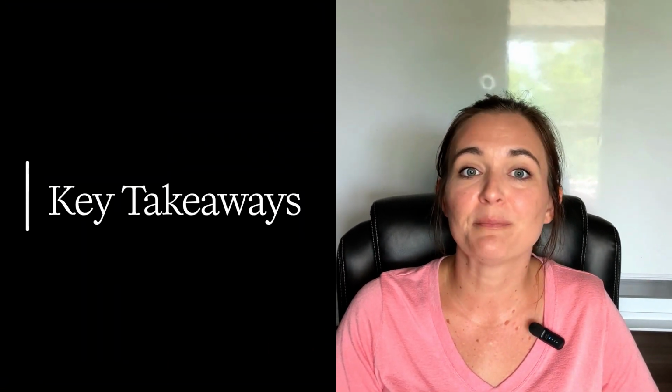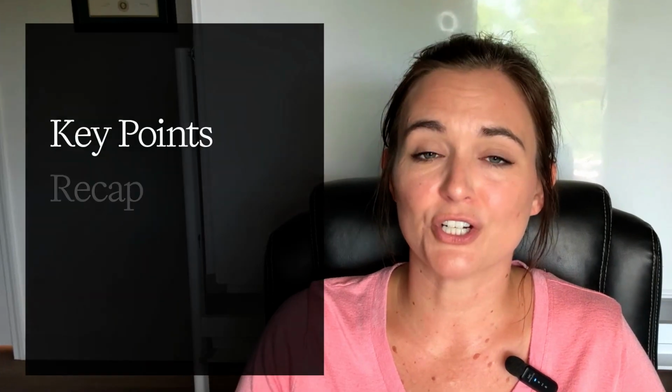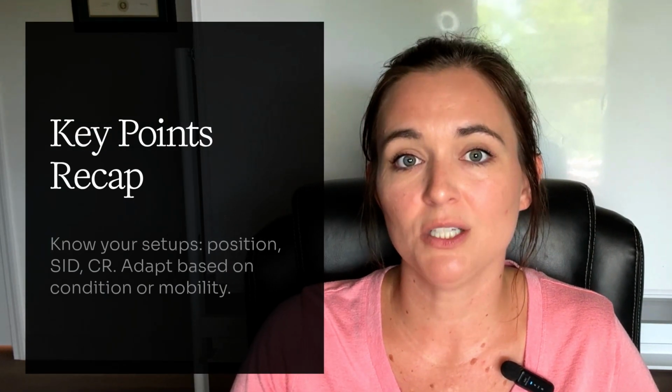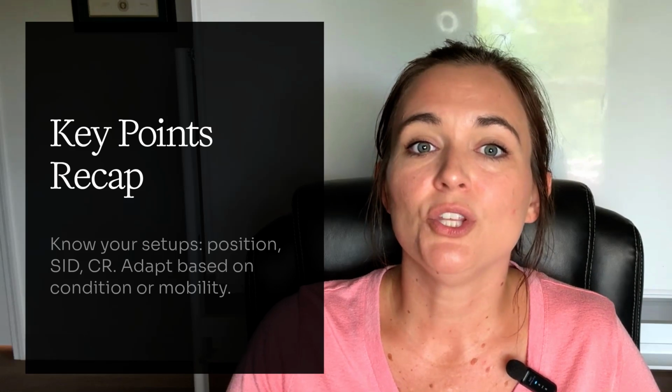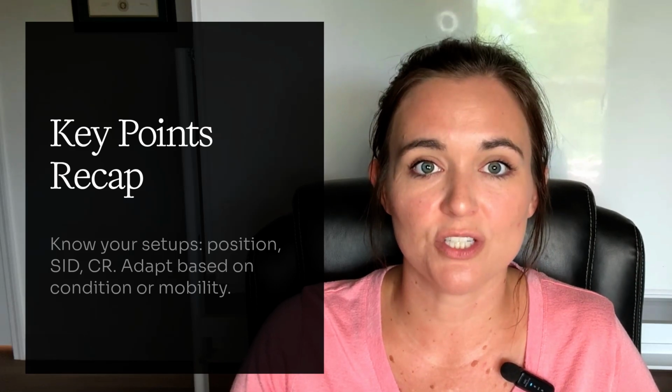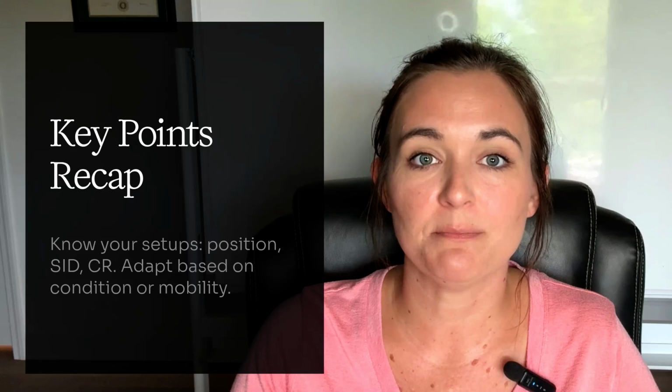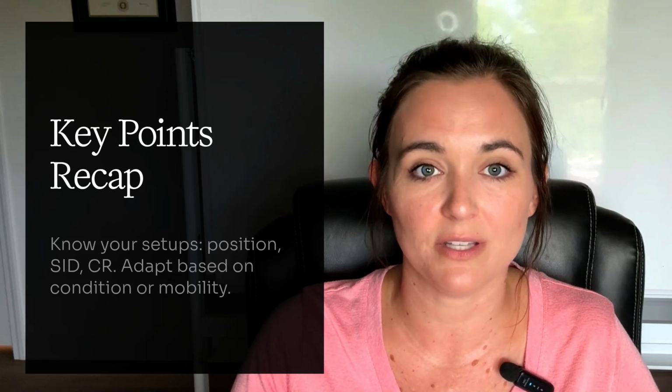All right, Rad fam, take a breath. You just made it through an entire spine imaging masterclass. We covered a lot. Let's bring it all together with the big takeaways. First, know your setups. Whether it's routine, trauma, or motion views, you have to know your patient position, SID, CR, and when to adapt based on condition or mobility.